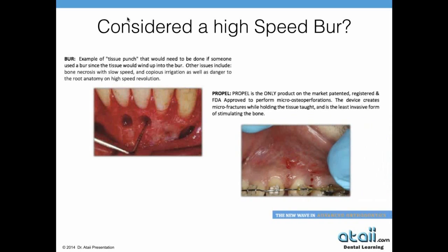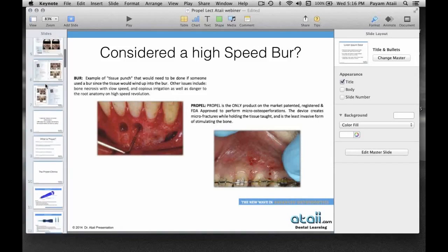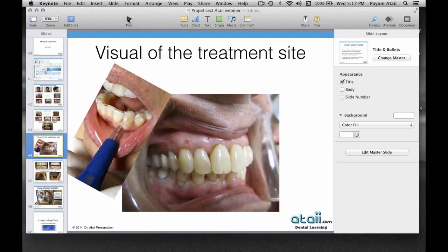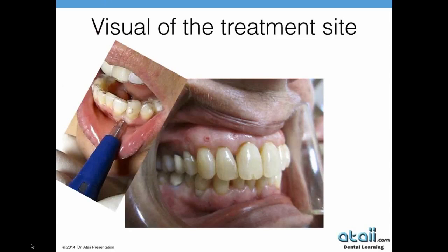And another doctor asked me where to put the Propel. Well, it's right in between the roots. And really, you don't have to go so far apical, but just know that you're trying to create that cytokine activity. You're trying to create that microosseous perforation to create that inflammatory process. So don't worry if you've done 2 or 1. As you saw in my earlier first case, it was very difficult for me to calibrate the patient on where to put it, and she even had some loss of gums and dehiscence, which I'll show you again. In her case, it turned out just fine. And if you see where we've put this right along, you can simply see these in between the roots.